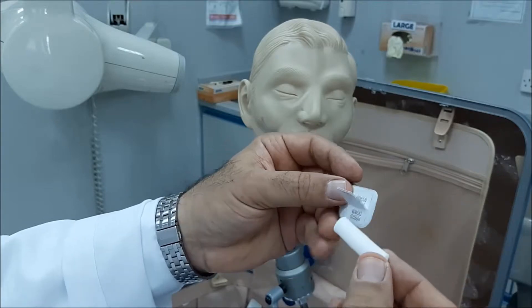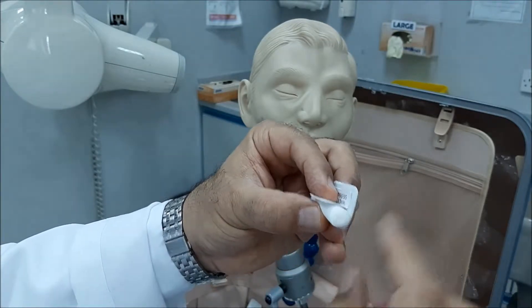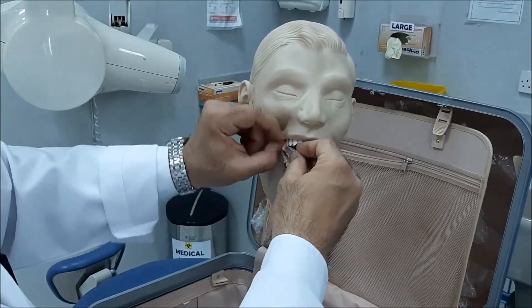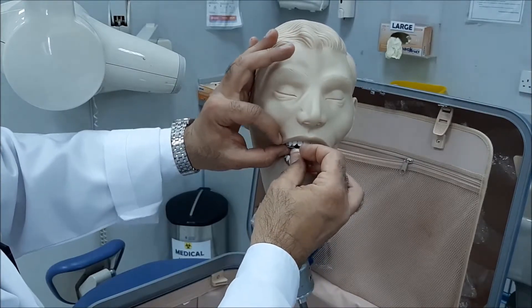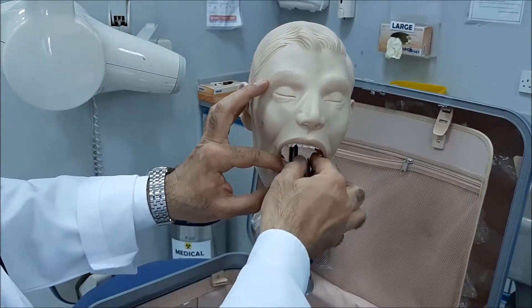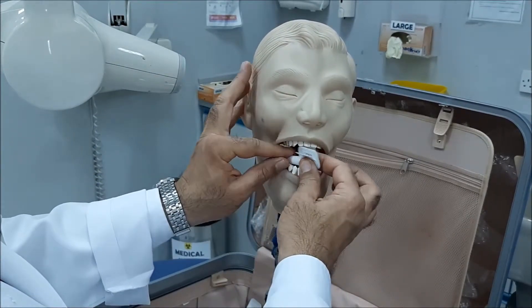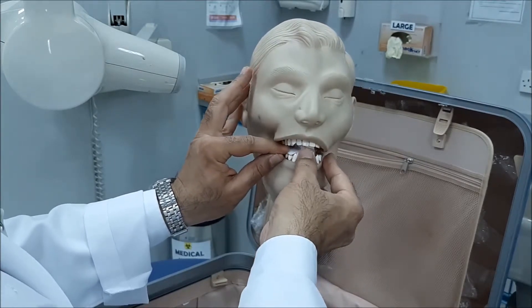The reverse goes on the other side. If the lower teeth are missing, then you're going to replace the crown with a cotton roll. I'm doing the premolars now — imagine that the lower premolars are missing and then you ask your patient to bite on the cotton roll, just to fix or stabilize the film inside the patient's mouth.